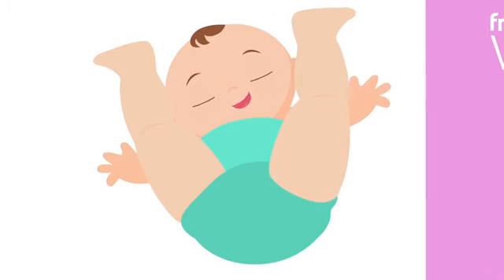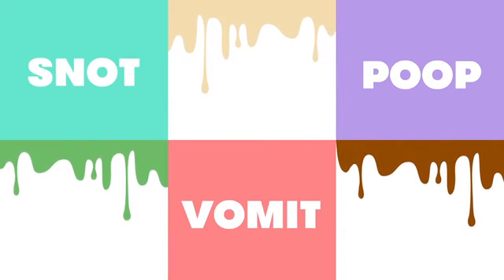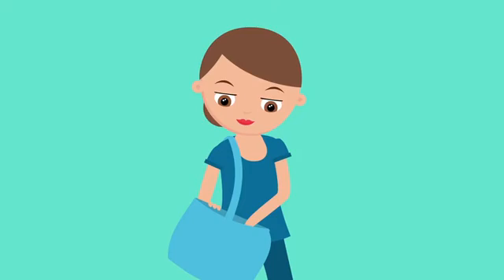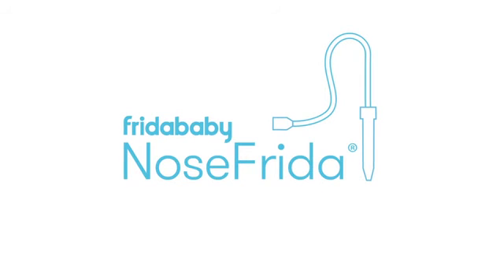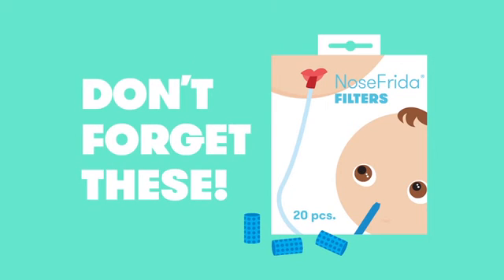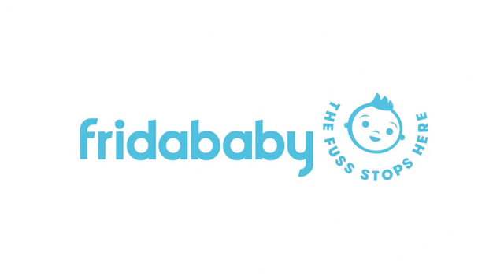No, not that call — we have another tool for that. You will do grosser things as a parent, so when they're stuffed up, it's time to buck up and suck the snot up with Nose Frida. Oh, and don't forget these. Stuffy nose, you've got this. Frida Baby — the fuss stops here.